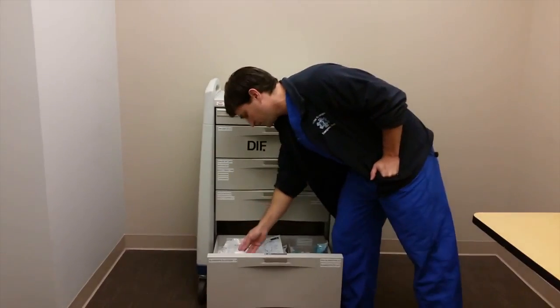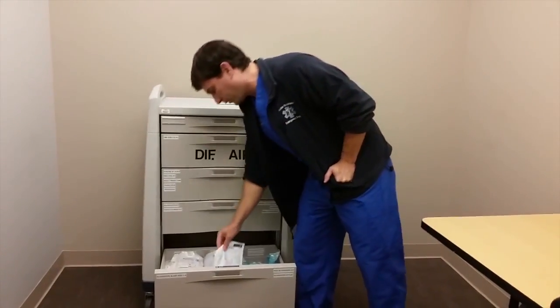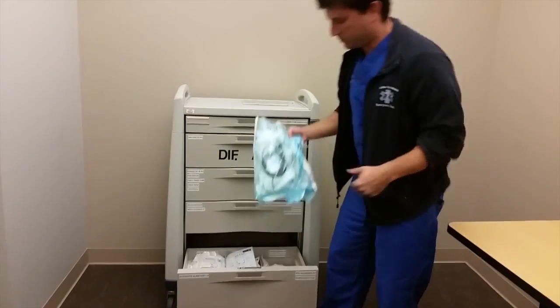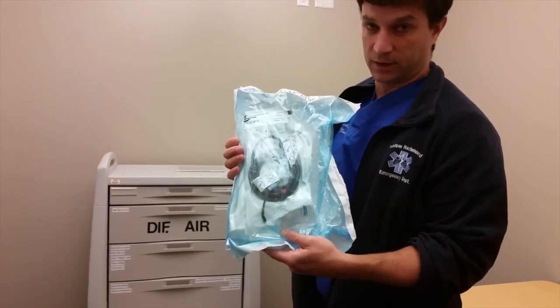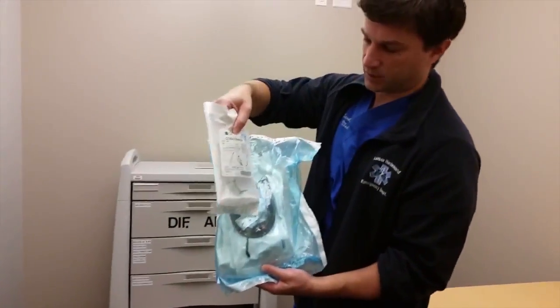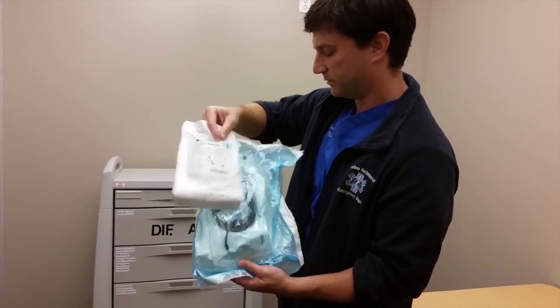But just so you know that they're here, the pediatric size is here as well. The pediatric sized glide scopes go from 1 to 2, and the adults are 3 and 4. So you've got 1, 2, 3, 4 sizes in here. The pediatric glide scope connection is in here because it takes a different size camera that has to go in with the pediatric size blades. So you can see that they are color coded. You've got the light baby blue part and light baby blue handle there for the pediatric glide scope stuff.